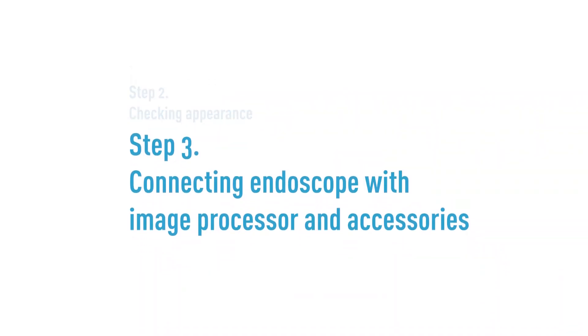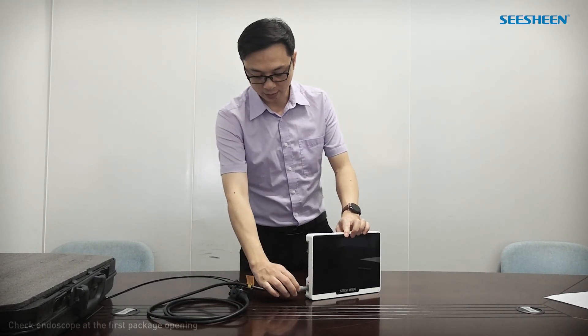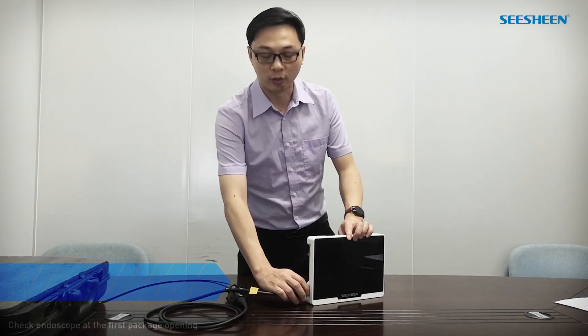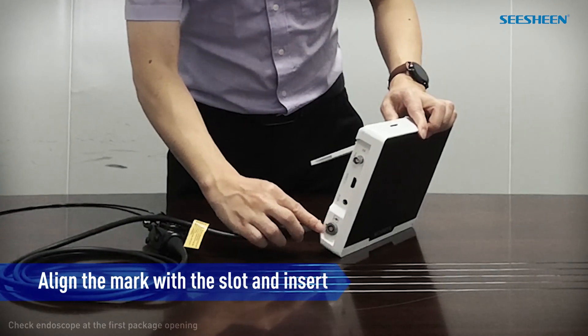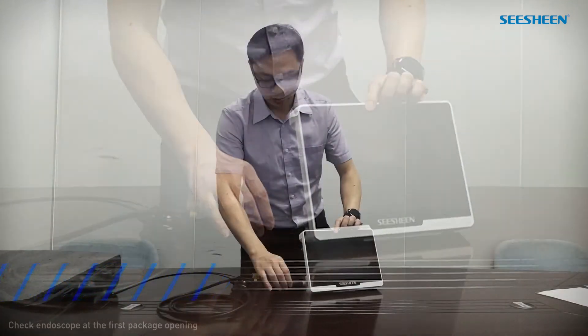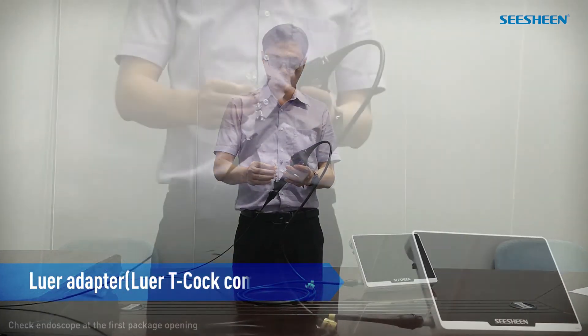Step 3: Connecting the endoscope with the image processor and accessories. Hold this port and insert it into this port. Please be careful — there is a direction requirement. Align the mark with this slot and insert. Inserting in the wrong direction may damage the connector. Install this oval adapter.